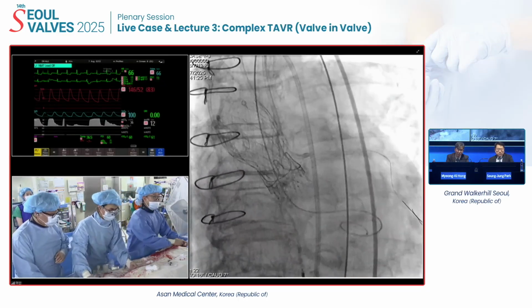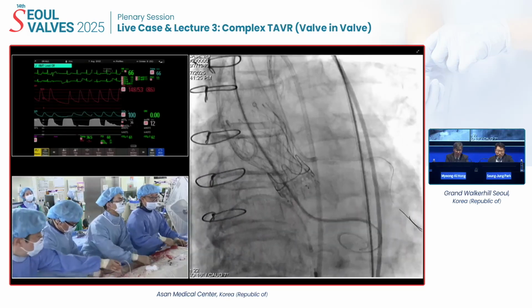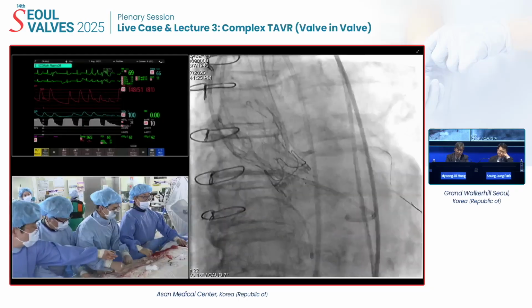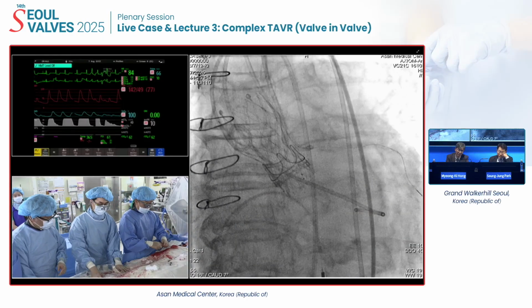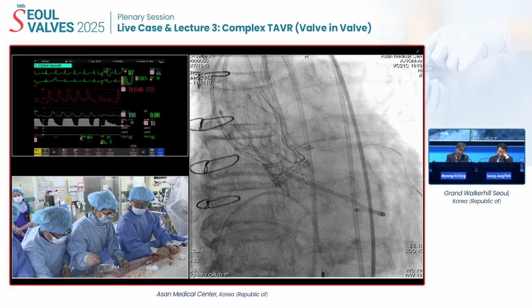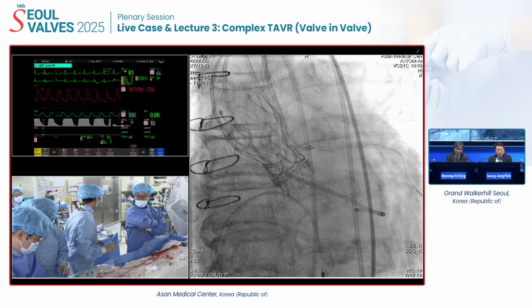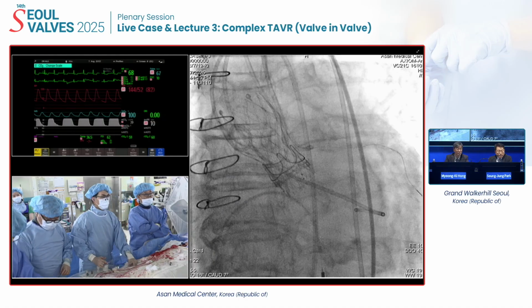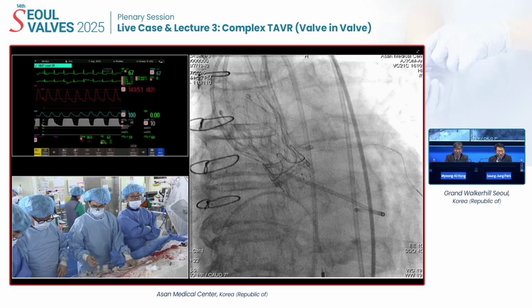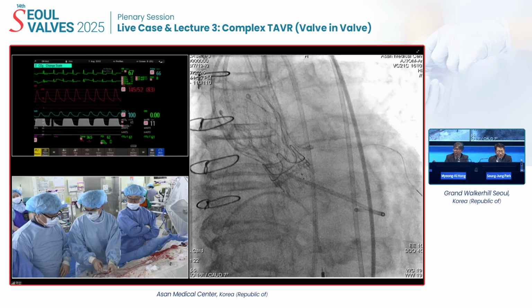And first, we measure the pressure gradient. There is some remaining pressure gradient, and we have put the 23, a very small size. 그다음 밸브 요거는 바꾸기만 하면 돼. I'm gonna show the pressure gradient. For us, this is quite normal.